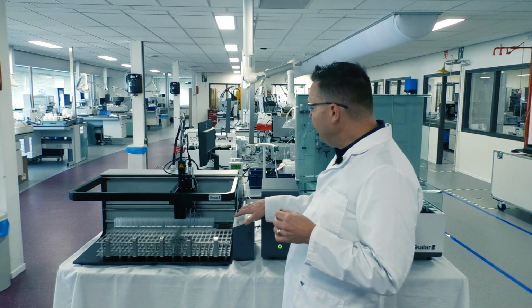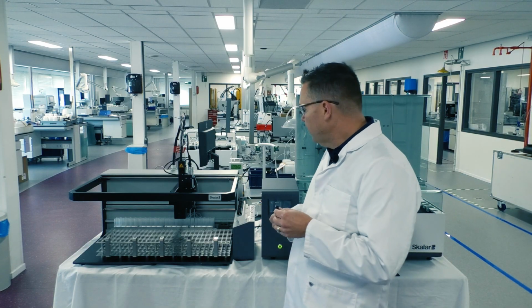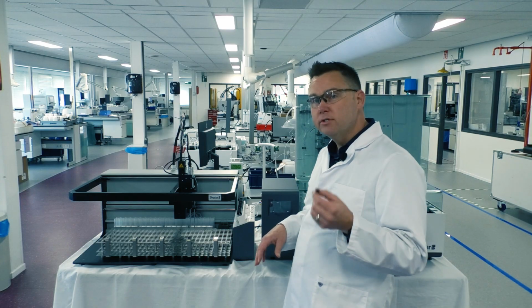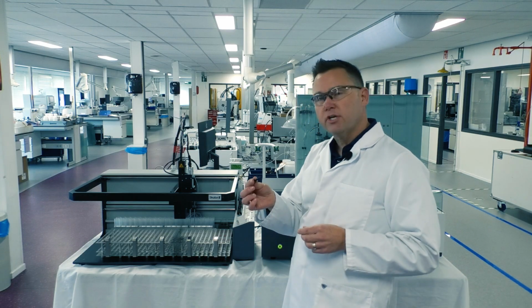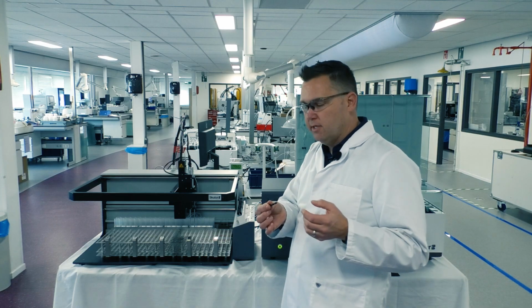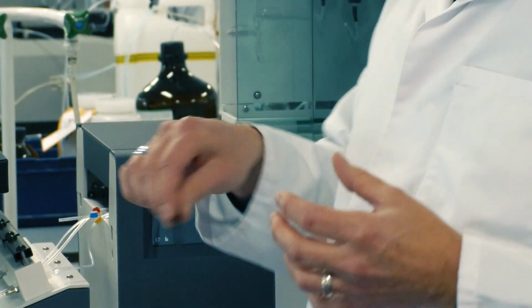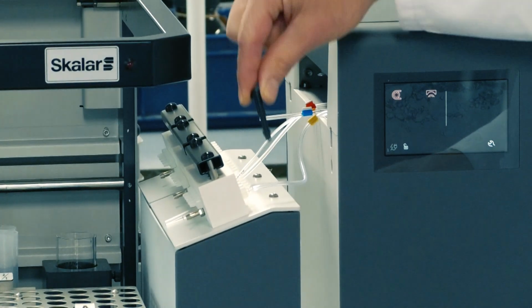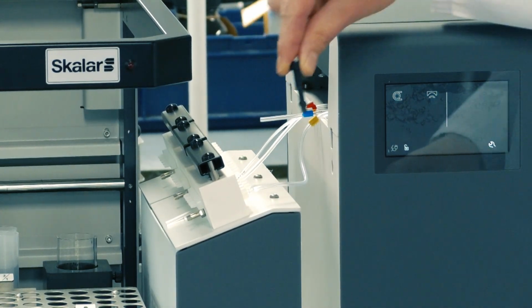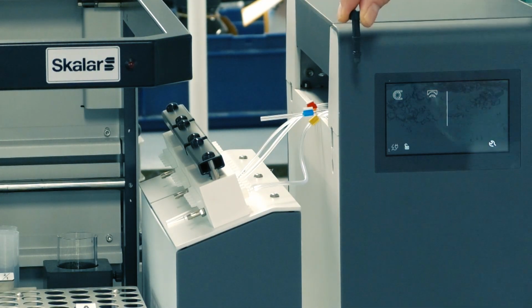They're mainly maintenance free. So once a year we recommend on your PM visit by a Skalar engineer, or your users can do it themselves, you remove the tops of these valves, and these little plungers come out, and there's a series of O-rings that we replace annually to make sure that they're sealing really well as they slide. Because in essence, if you can visualize, they're just pulling these rinse valves up and down to divert the flow from reagent to DI water to rinse the system out, and then vice versa.